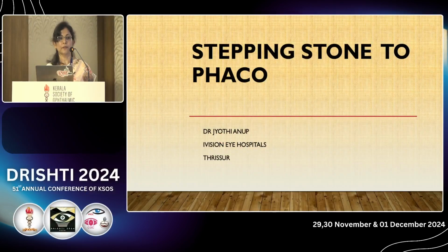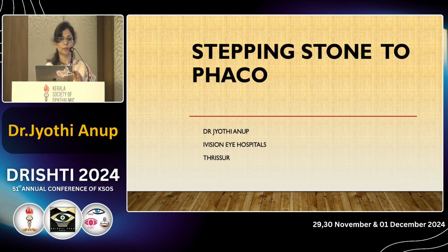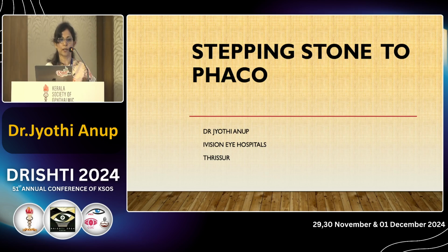About Dr. Preethi's presentation, SICS also should be done step by step. The first 5 cases, this is what we do: rectus, peritomy, cautery and scleral groove is done. Subsequent next cases, till scleral dissection is done. The next 5 cases, capsulotomy and hydro procedures and nucleus prolapse.